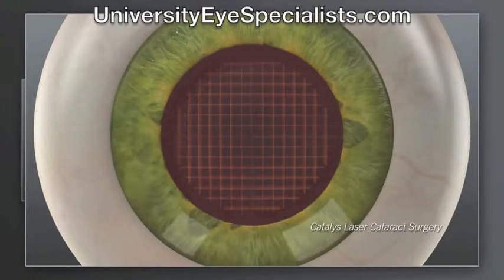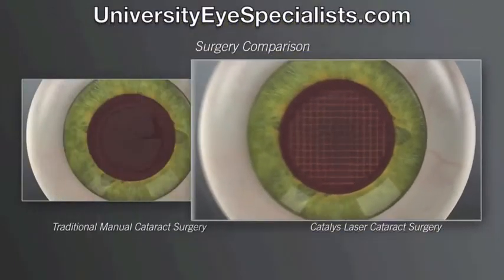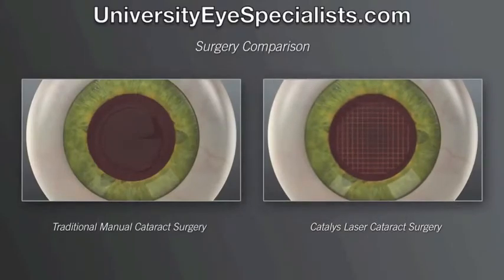Shown here is the laser grid pattern. The next step in both traditional and laser cataract procedures is to remove the capsule flap and the cataract.